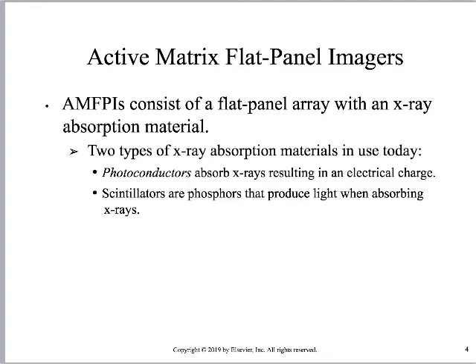To do that, they're going to use an active matrix, right? So this is going to consist of a bunch of technical jargon, right? But what she calls it is a flat panel array with X-ray absorption material. This is illustrated in our textbook on page 66. And so it shows us the X-ray absorptive material and the detection matrix that's beneath that absorption material. And then it has a bunch of integrated circuits that are then used to read out that matrix.